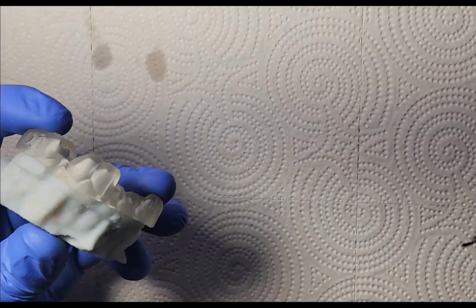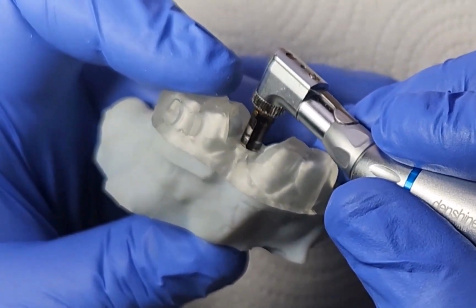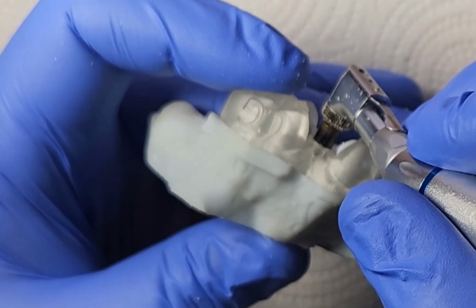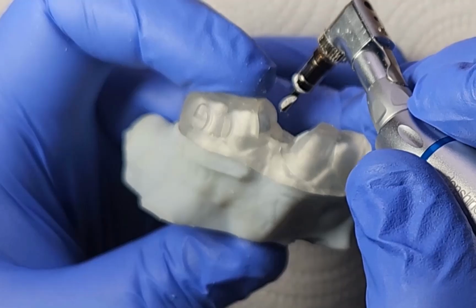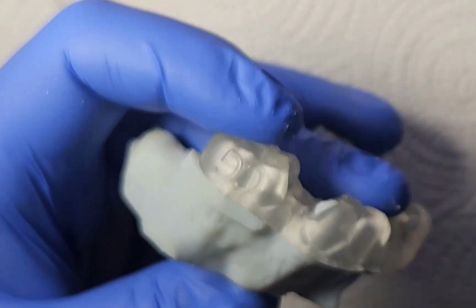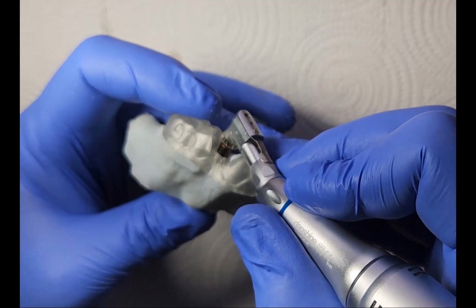And so we'll just go through the drilling sequence. So this is not a true implant motor, so bear with me on the simulated nature of this, but hopefully we can get it to go all the way to depth here.